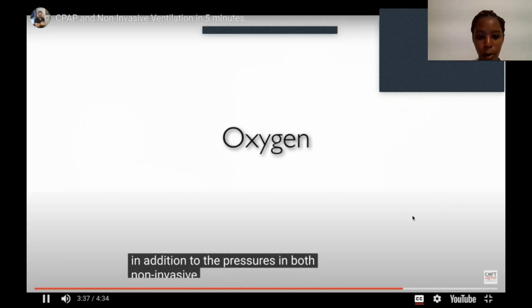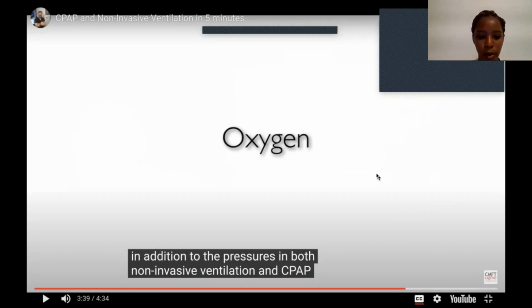So maybe we just pause. Something of note when you said there, we said that since you'll set these two pressures, it means at any given time, if you've set maybe your PEEP, we said patients with ARDS, you're going to give them a higher PEEP.